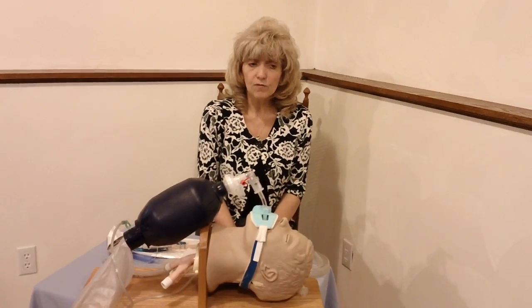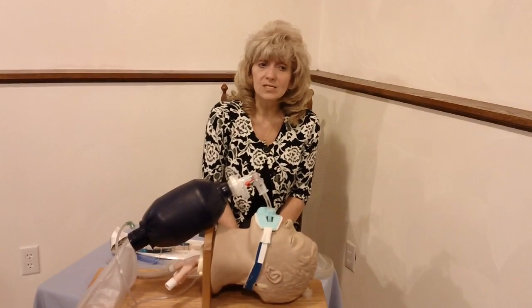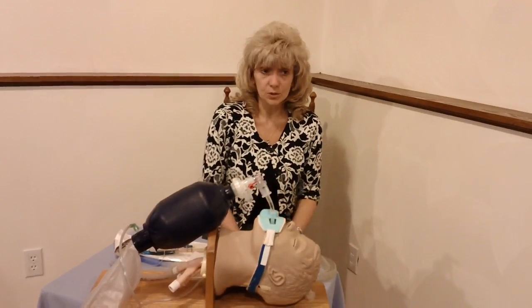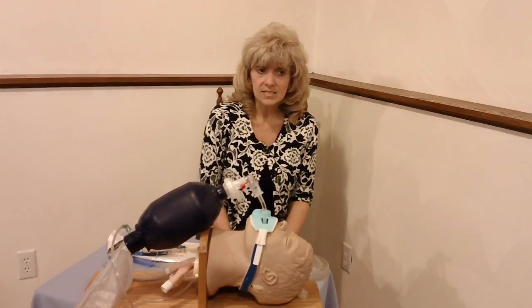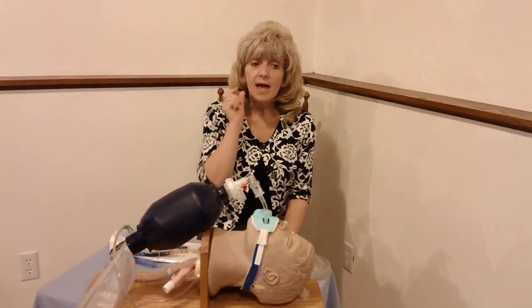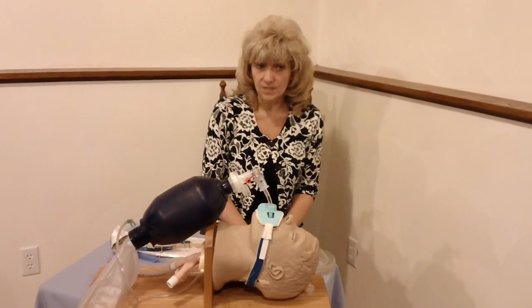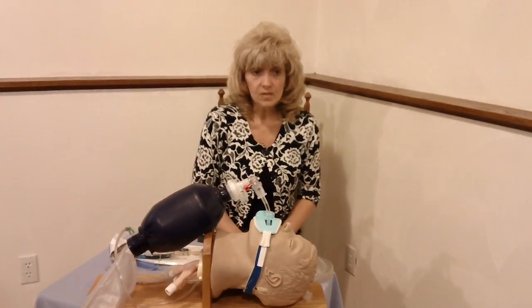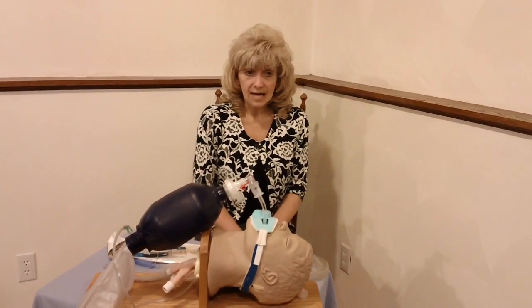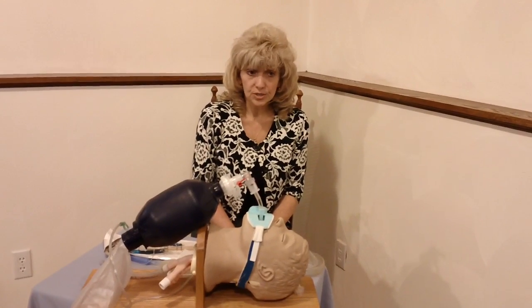We also have nasopharyngeal airways. They are a soft, pliable, hollow tube that is inserted into the nostril to assist with ventilation. It bypasses those obstructions. The selection of the size, it's measured the distance from the tip of the nose to the earlobe, and when you insert this, the bevel is toward the base of the nostril, toward the septum. Those are nasopharyngeal airways.